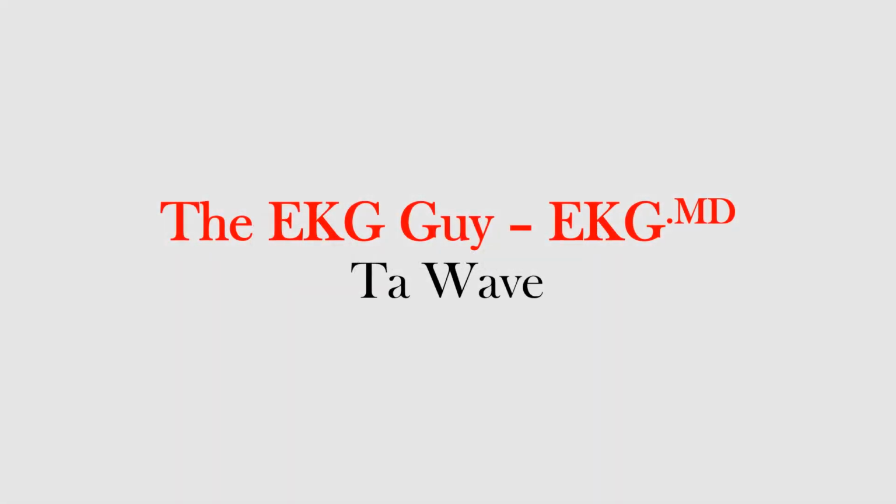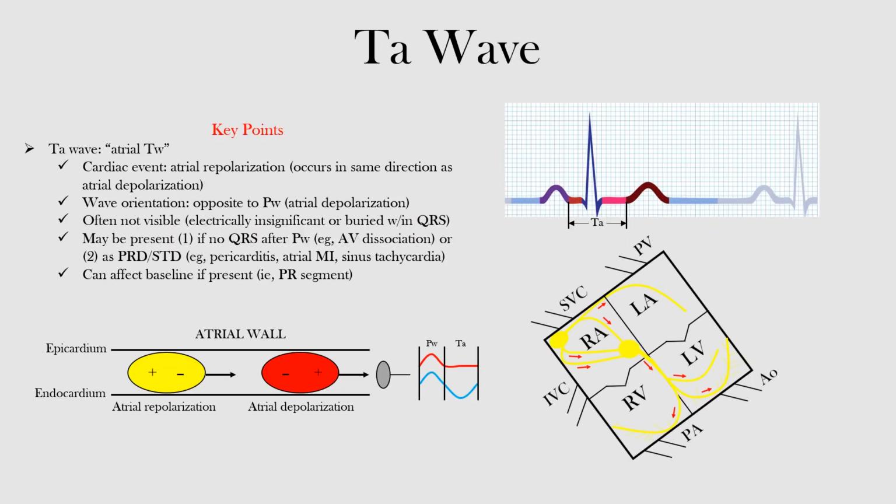In this lecture, we will discuss the TA wave, specifically what it represents and how it appears on the EKG. The TA wave represents atrial repolarization. If you recall, ventricular repolarization is the T wave, so you can think of this atrial T wave as being a repolarization wave of the atria, okay? So TA wave being atrial T wave, okay? Atrial repolarization is what it represents.